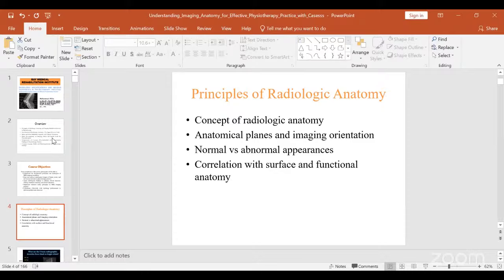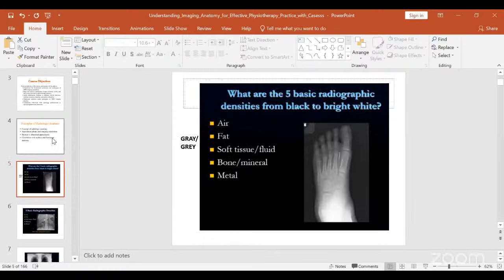All right. Then, of course, we now go to correlate with clinical conditions and then what to look out for. Example, somebody who had a clinical history of fall from heights, and when I'm assessing his radiograph, of course, then I should be thinking about fracture. I'll be thinking about bruises. I'm thinking about these conditions, mechanical conditions. I don't know whether we'll get it. Okay. All right. So this is what I mean by correlating with clinical findings.